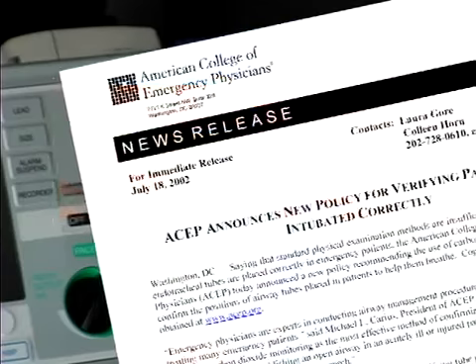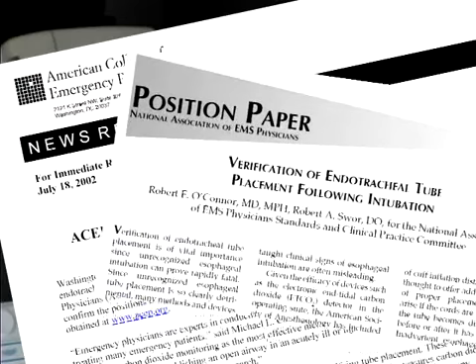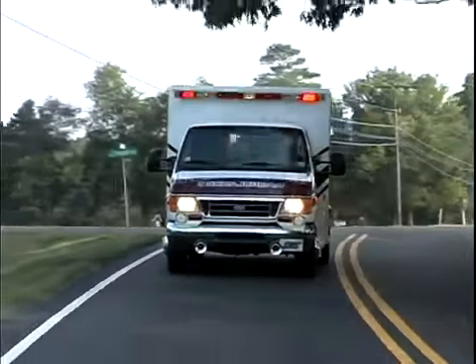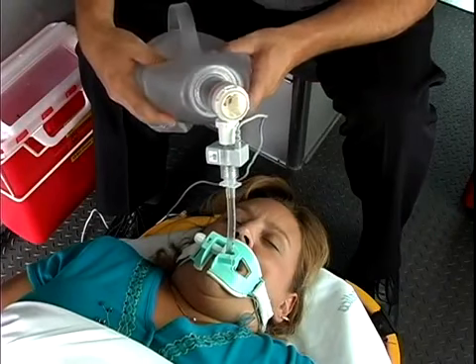care. The American College of Emergency Physicians and the National Association of EMS Physicians have also stressed the use of CO2 monitoring in EMS to verify endotracheal placement. It's becoming a standard of care that all EMS agencies continuously monitor tube position during transport, as this is providing advanced level care for the patient.